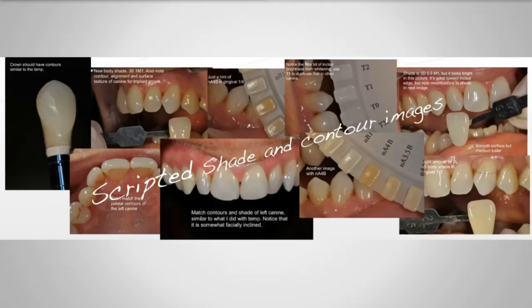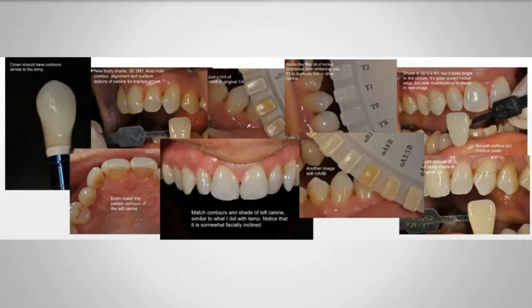I've gone to my lab a few times, and I've noticed that they've all got computer monitors there. Now remember, Angela, even though it's a single canine, I really want to get this color and contour just right to match that other tooth. So what I do, I notice the lab, they're looking down at the lab, then they're looking up at the monitor back and forth. There's something lost in translation there. Send out very simple programs. There's iDraw for the Mac. There's Adobe Photoshop Elements. That's a cheap program you can use with your PC or a Mac to add scripts to your actual JPEGs and send those pictures electronically.